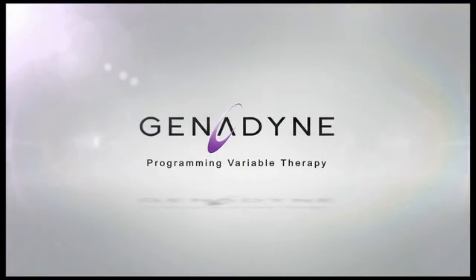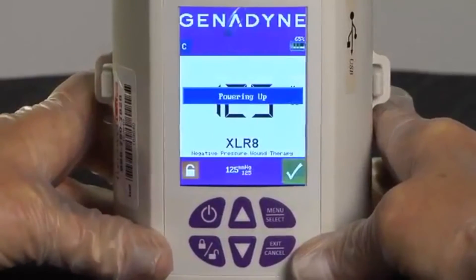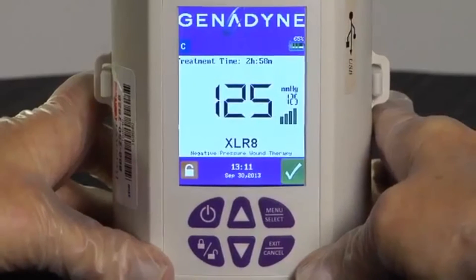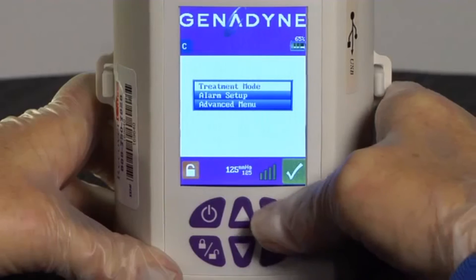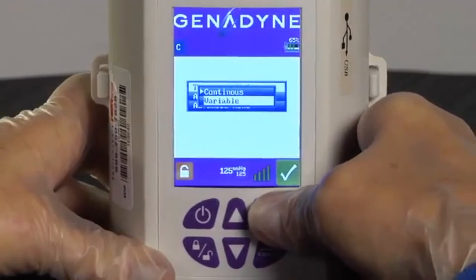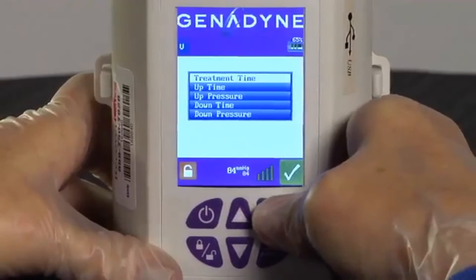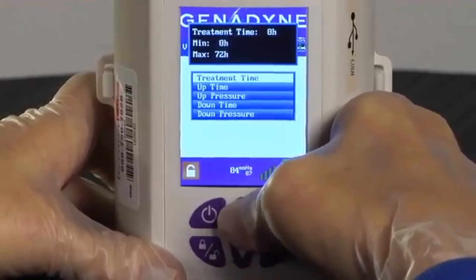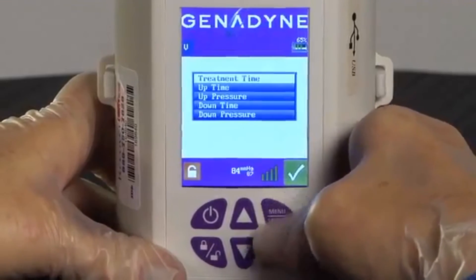Programming Variable Therapy. To program Variable Therapy Mode, turn the pump on by pushing and releasing the On-Off button. Press the Menu Select button; the menu will appear. Use the Up or Down button and choose the Treatment Mode function by pressing the Menu Select button once. Select the Variable Mode using the Up or Down button and press the Menu Select button. Now scroll through the menu to set the Treatment Time and push the Menu Select button. Using the Up or Down button, set a Treatment Time, then press the Menu Select button to save the setting. The pump will return to the menu.